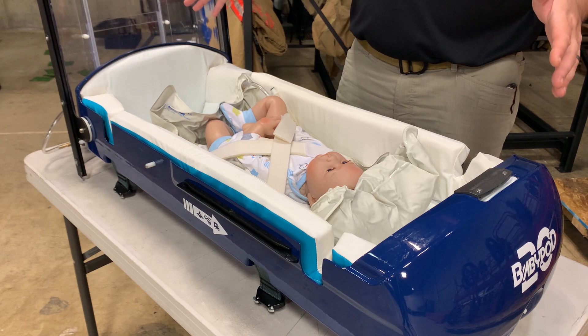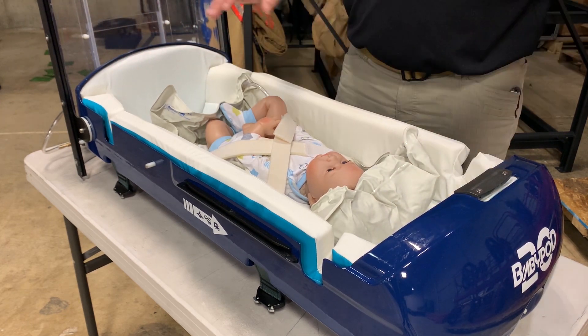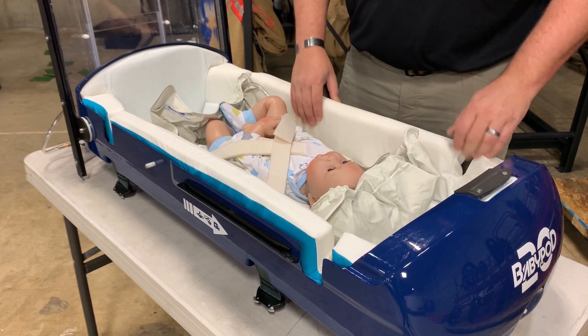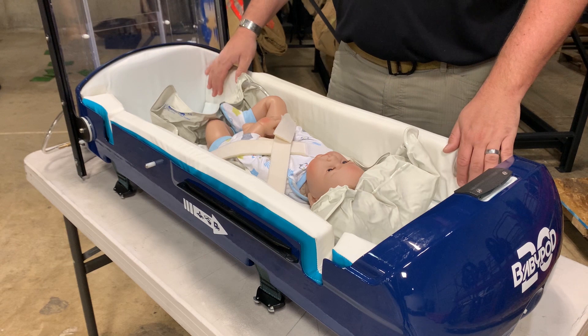First, we have padding all the way around. This padding is completely washable — it can be wiped down with whatever disinfectant after use, and it just snaps in and out of the pod. This provides the outer layer of protection in a crash and also insulates the child from vibration.